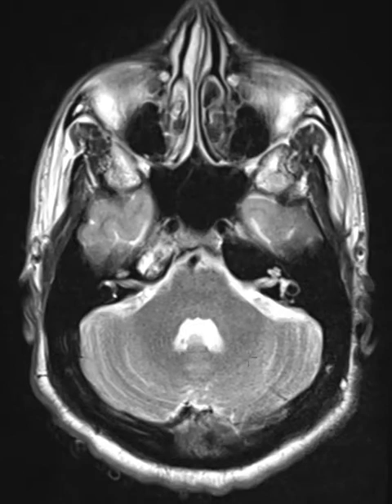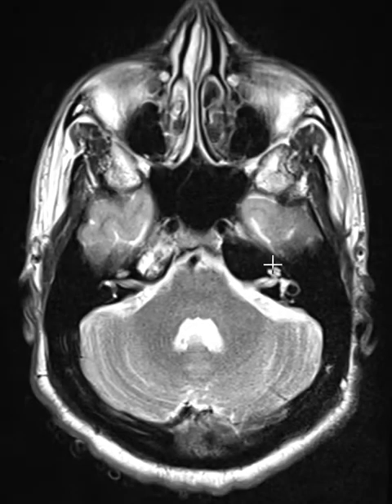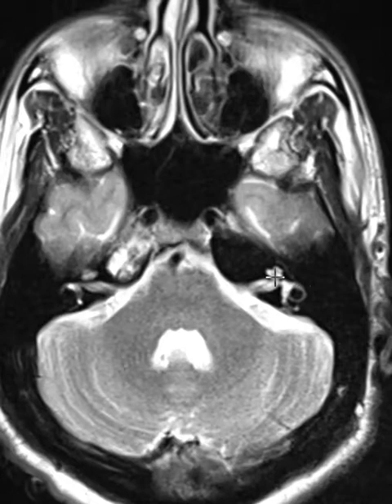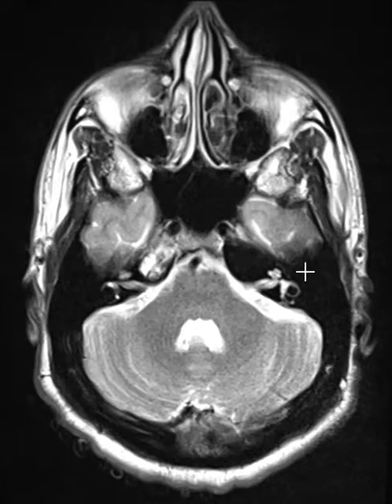This is the cerebellum, and on the left-hand side we see the internal auditory canal, which is this little horizontal area. We see the inner ear structures — this is the cochlea that gives hearing, and we have the semicircular canal here, which gives balance. This is one of the three semicircular canals. These inner ear structures on the left appear normal, and we see they are surrounded by darkness — a combination of air and little bony struts like honeycomb.